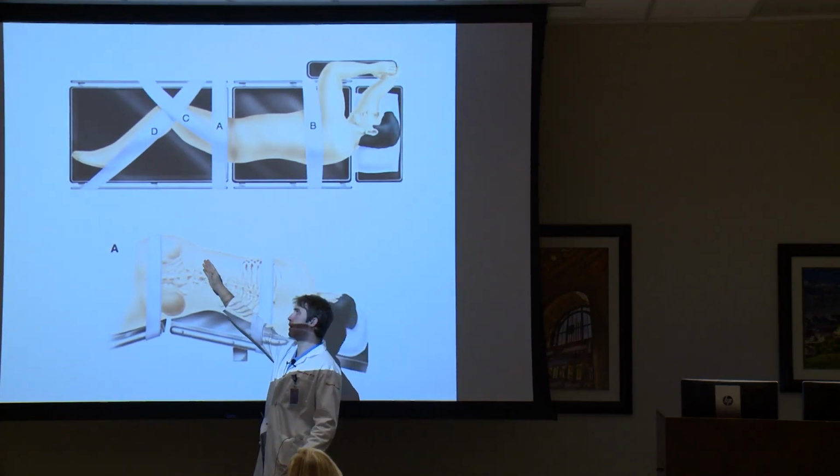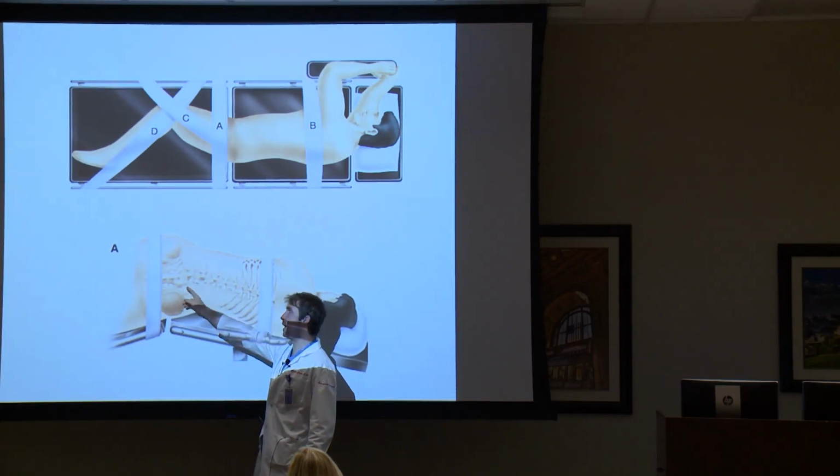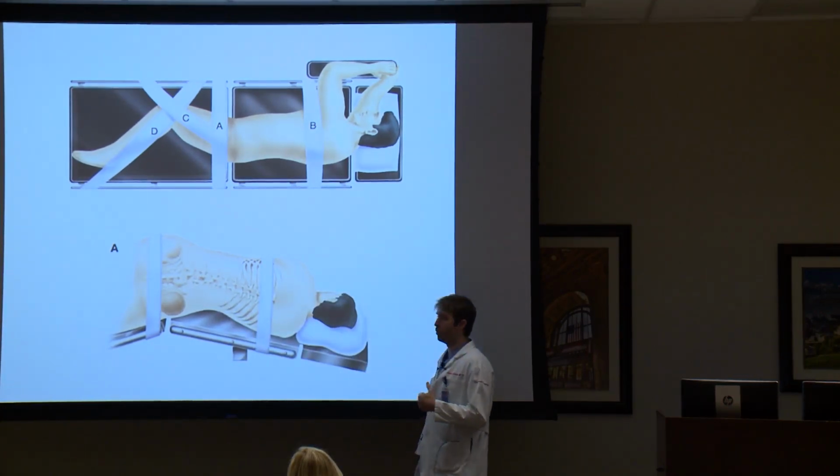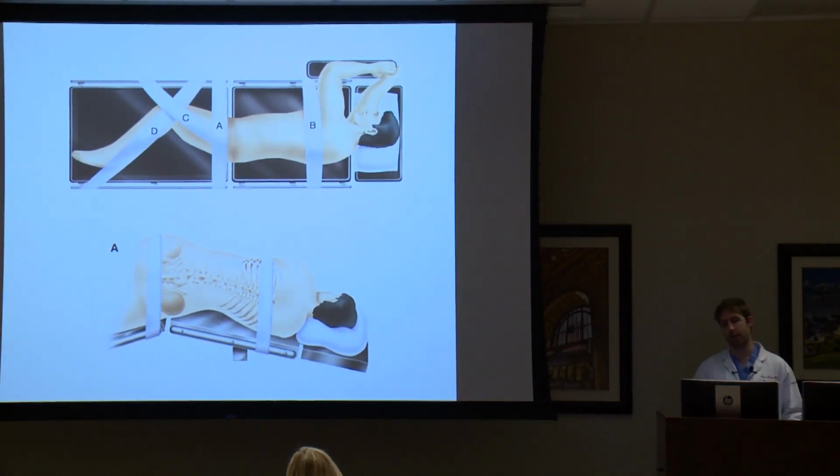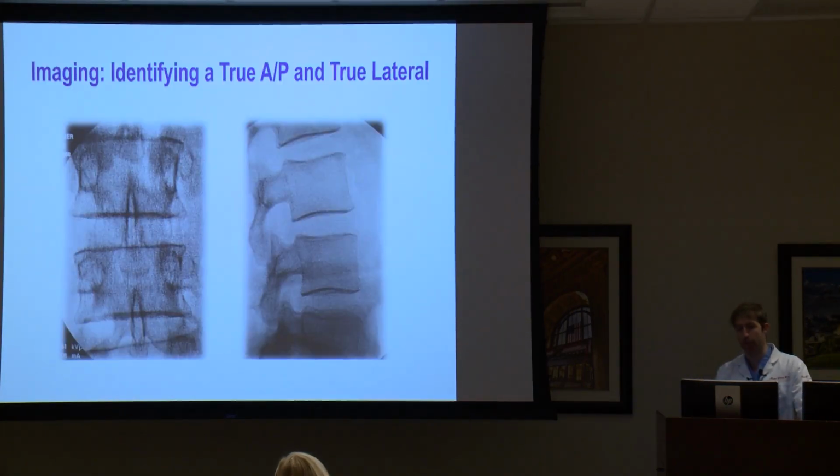If you break the bed, you can get them open enough so that you can come down at L4-5. And again, we'll talk about it in a second, but the nerves are a big thing too at L4-5. And that's why people for a long time only did above 4-5. They did 3-4, 2-3, 1-2, that kind of stuff. But typically this is how I tape the patient down, and then I'll have the x-ray come in, and I'll start moving the bed. I won't move the patient. And once they're locked in, hopefully as straight as can be, you start taping them down, and you start rolling the bed one way or another to get those views so that it looks just like that.